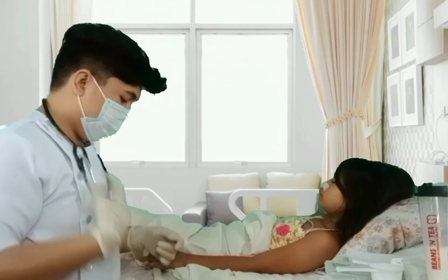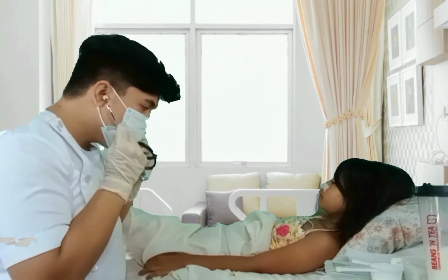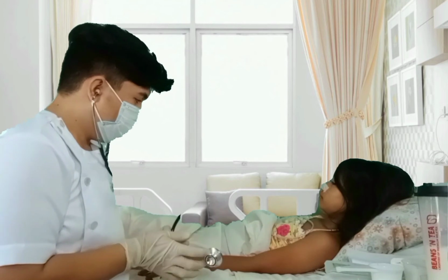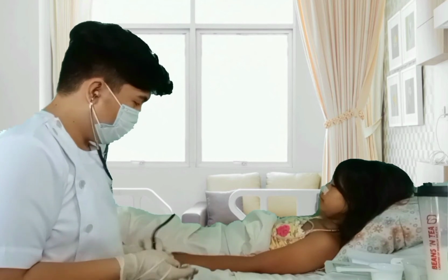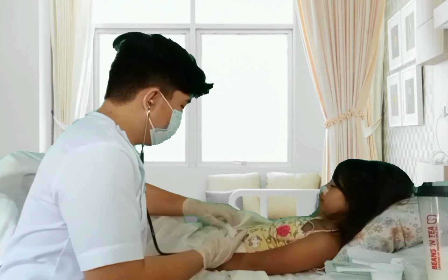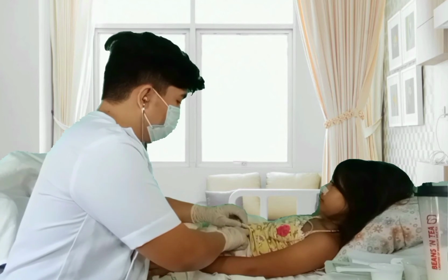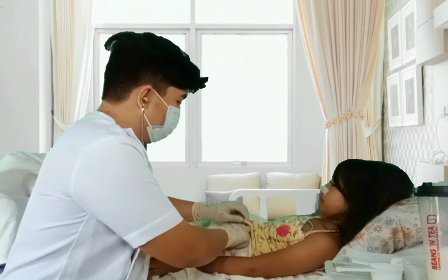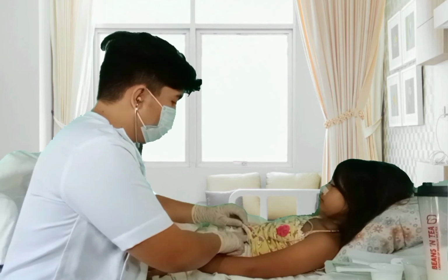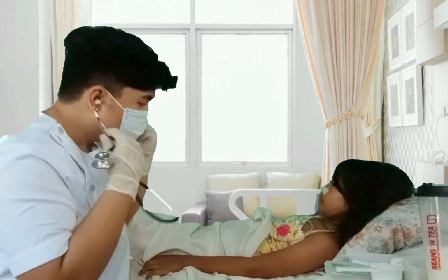Step 5. Determine tube placement. Aspirate gastric contents to check for gastric residual. Return aspirated contents to stomach unless the volume exceeds 150 ml. Presence of gastric secretion indicates that the distal end of the tube is in the stomach. Residual volume indicates if gastric emptying is delayed. Delayed gastric emptying may be reflected by 150 ml or more remaining in the client's stomach.